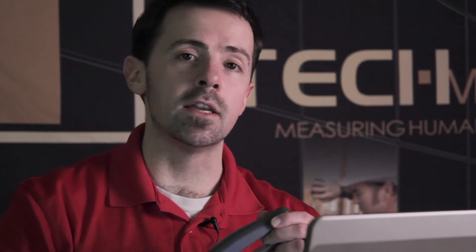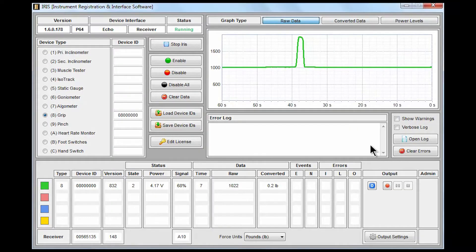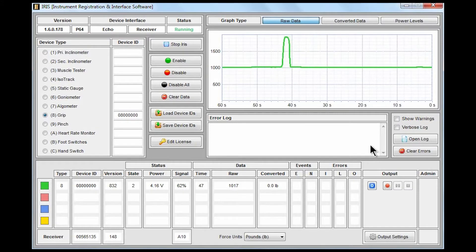For today's demonstration I'm going to be using a JTEC grip strength gauge. You may have seen it in other capacities before, a standard five position grip strength unit. And you'll also need a receiver of some sort, in this case one of our USB freedom receivers. It is able to establish connections to up to four devices simultaneously.